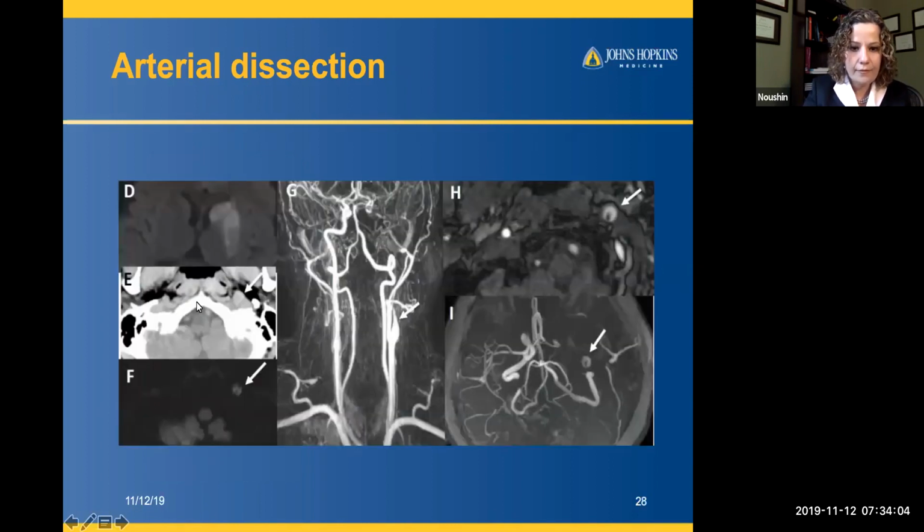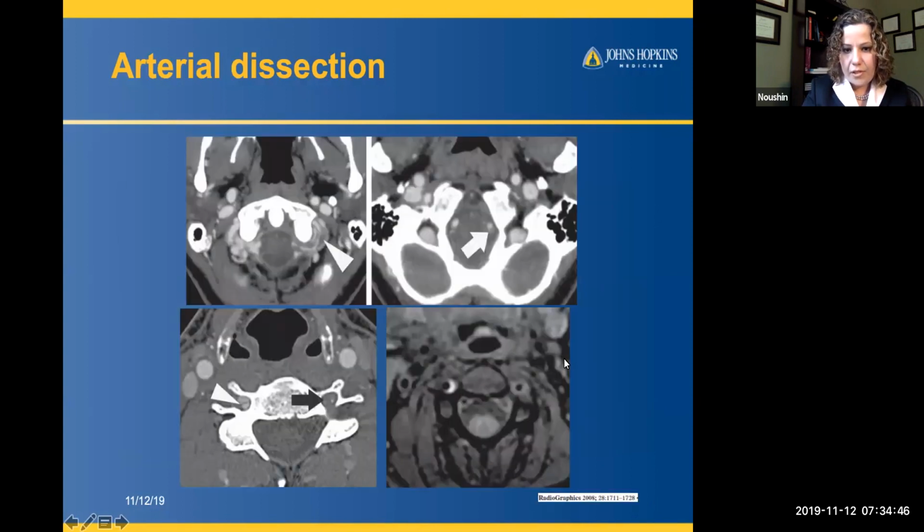This is an example of carotid dissection. Patient comes in with left basal ganglia infarcts. On non-contrast CT, you can actually see the left carotid at the level of skull base is a little expanded with clot within it. On diffusion, sometimes you can actually see the thrombus. This was a contrast-enhanced MRA, which shows abrupt occlusion of the proximal internal carotid artery right above the bifurcation. This is a time-of-flight image that shows intramural hematoma. Sometimes they call it a double lumen sign. It's helpful if you see it. You don't see it all the time. And this is a MIP image.